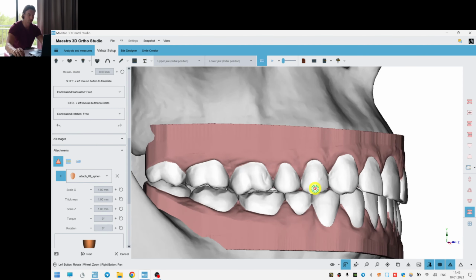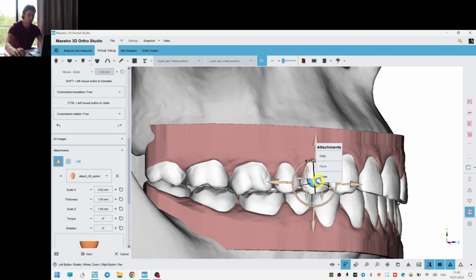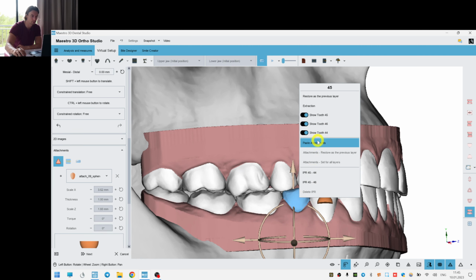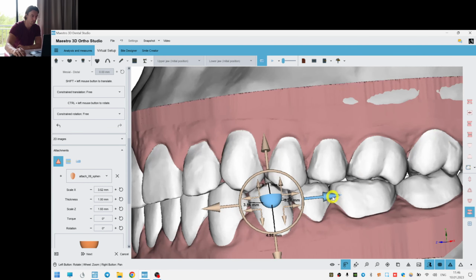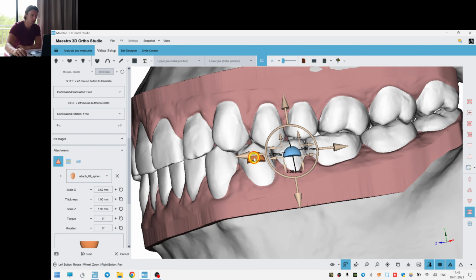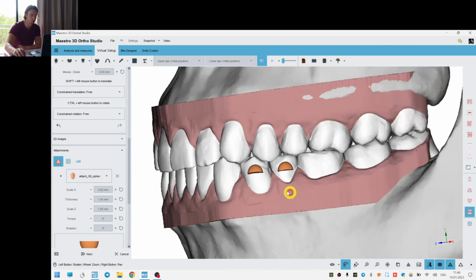So I always use this kind of retentive attachments. If we make an intrusion of more than 2 teeth, I would place at least 4 attachments for that arch. So here we intrude all the incisors, so that we need to have at least equal number of the retentive attachments. As many attachments as many incisors we intrude.